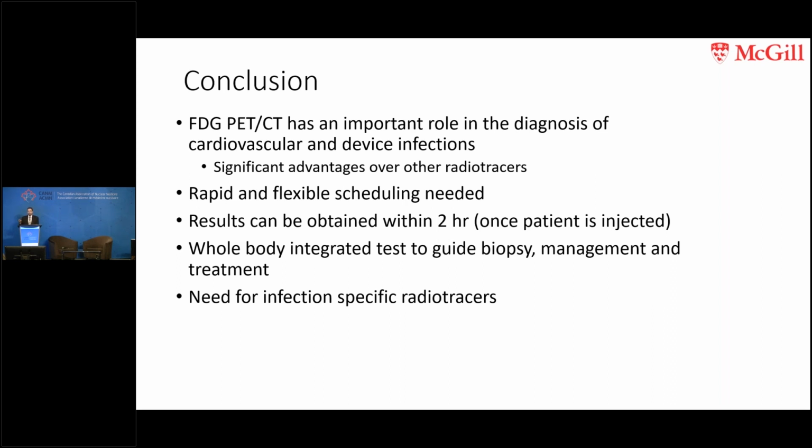We need to respond very quickly, image the patients very quickly. We can't wait a few days or weeks to give them appointments. We have to respond to the demand and schedule them when they're clinically necessary. Once you inject the patients, you get the results within 2 hours. You can have the report out rapidly. Changes in management could happen quickly.